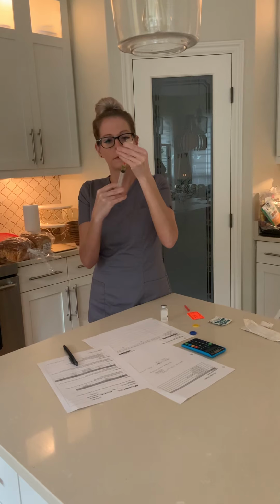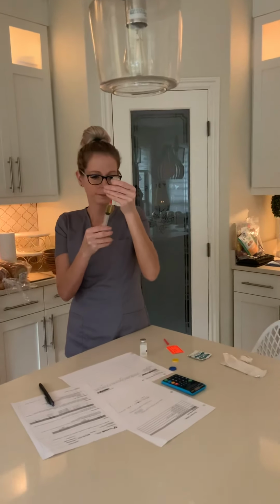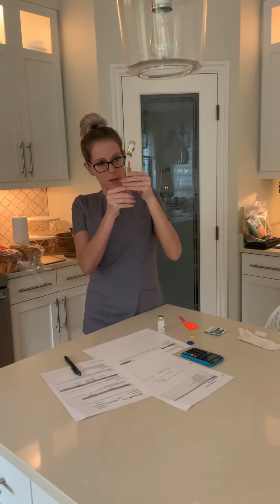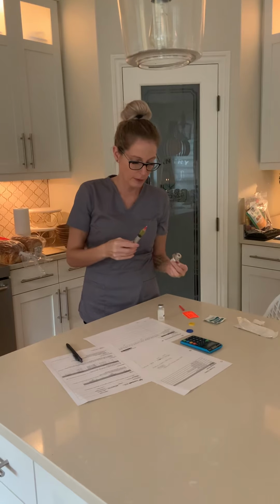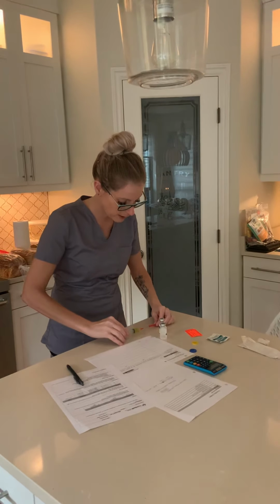There's another bubble. So I'm just going to try it again here. That's better. And just double check air bubbles. So I've got 4. Okay. So at this point, I'll passively recap.